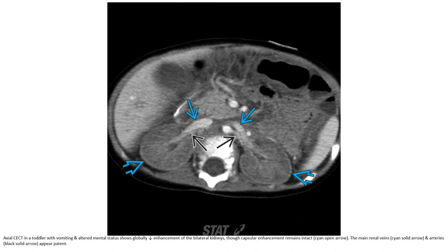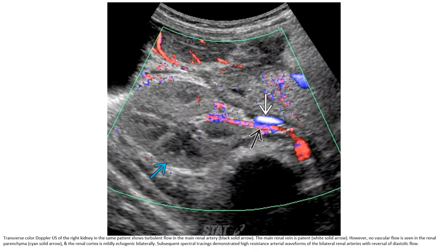Contrast-enhanced CT in a toddler with vomiting and altered mental status shows globally decreased enhancement of the bilateral kidneys, though capsule enhancement remains intact. The main renal vein and artery appear patent. Doppler of the right kidney in the same patient shows dampened flow in the main renal artery; the main renal vein is patent, and no detectable flow is seen in the renal parenchyma. The renal cortex is markedly echogenic bilaterally. Subsequent spectral tracing demonstrates high-resistance arterial waveform in the bilateral renal artery with reversal of diastolic flow.